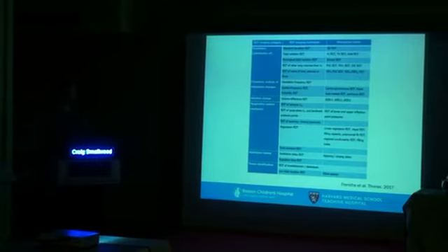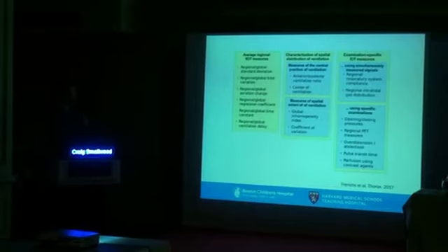And this is an example of a bunch of different ones. I'm going to show you a couple of key ones. I think the most interesting or practical are things like the Global Inhomogeneity Index. Essentially, we don't really care about what the total global impedance is, because that's basically tidal volume. What we care about is breaking that image up into smaller pieces, because we think that smaller, more finite information is what's special about this device and can tell us something that our mechanical ventilator can't already tell us.